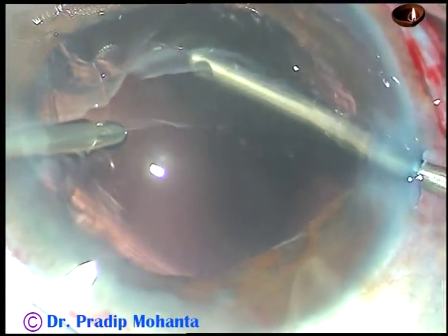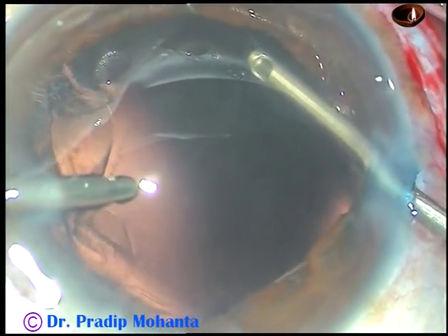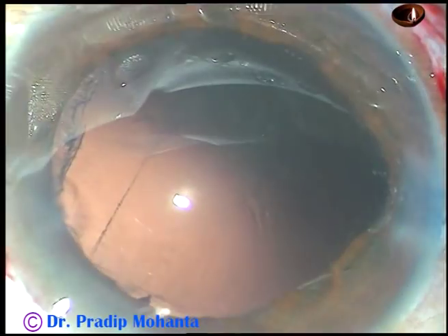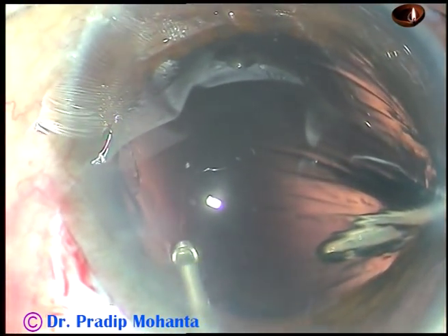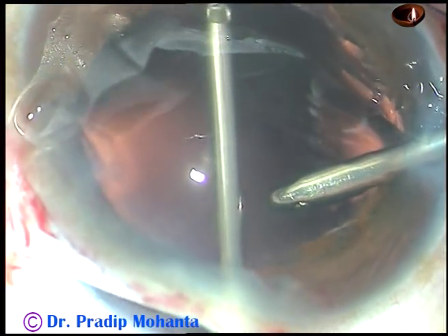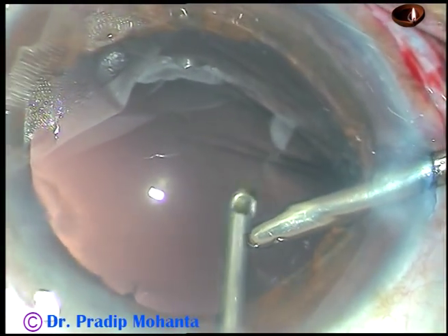The cut rate is 3500 at this moment, and this blade cuts on both sides. The port remains open all the time, so this is called continuous flow. In effect, the cutting rate is 7000 cuts per minute. The irrigation is from the right side port, and I'm trimming the capsule on the left side. Vitrectomy has been done very satisfactorily.